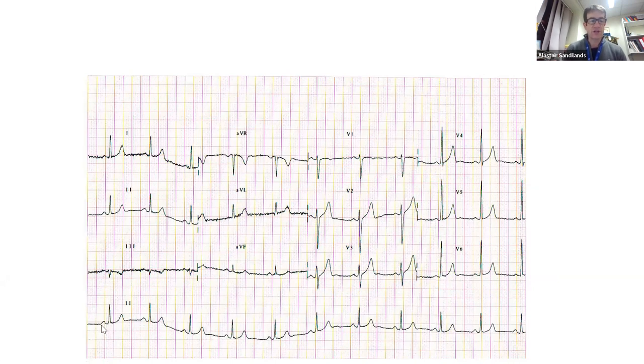So we know that we've got sinus rhythm. We've got a P wave before every QRS, and the spacing between every single QRS looks roughly the same. So we have a regular rhythm and we've got sinus rhythm. Okay. So sinus rhythm, 66, regular.